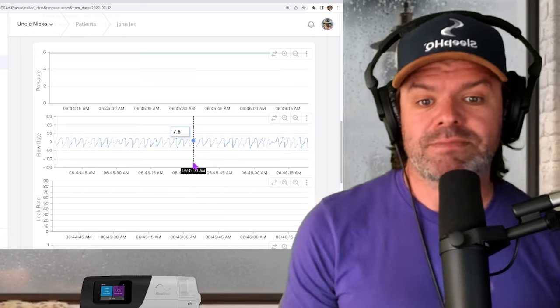On the flow rate graph, as the line moves up that's John breathing in, and as it moves down he's exhaling. You can see the bottom at the exhale is like a sharp point, but look at the top of the inhalation phase — it almost looks flat-lined. That flat line at the top is flow limitation.